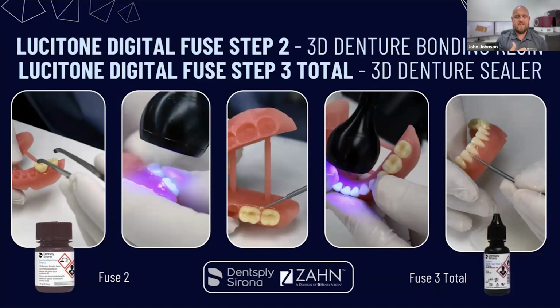And what's really great is you put just a little bit more material in those sockets than you need, allow it to spill over, ensuring that you've got enough in there. And then you're able to wipe it down on the base. You end up with those small print lines that need to be filled in anyway, so it's perfect to utilize that. And then the example on the far right is the Fuse 3 total, in how you're going to go back around, fill in any gaps that you may have had, and again, paint the denture.